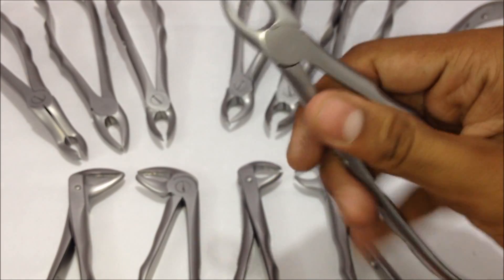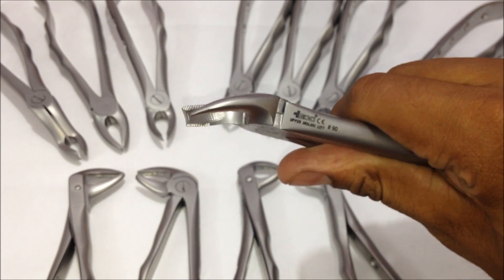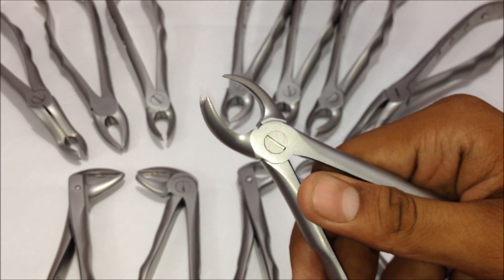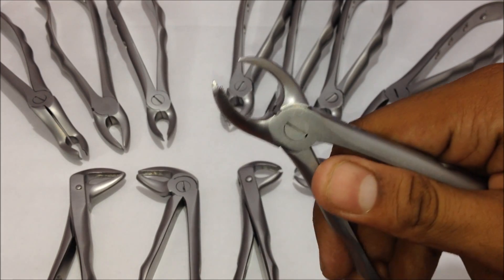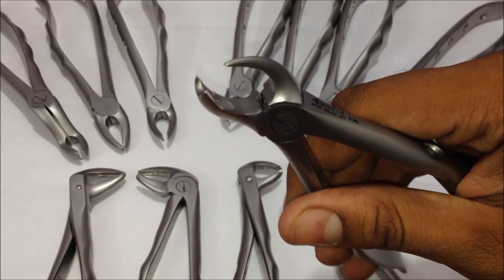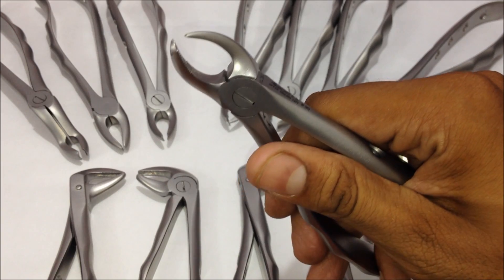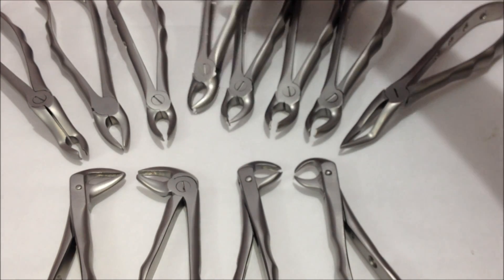The next one is the number 90, the upper left molar forceps. One beak has two sharp edges and the other has a single sharp edge — the single edge fits into a depression or furcation in the tooth as an access point to pull it out. The sharp point lodges into the tooth area, while the opposite two heads sit along the curve of the tooth. This is the number 90, used for the upper left molars.